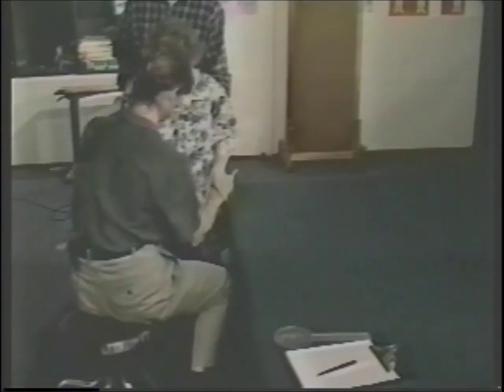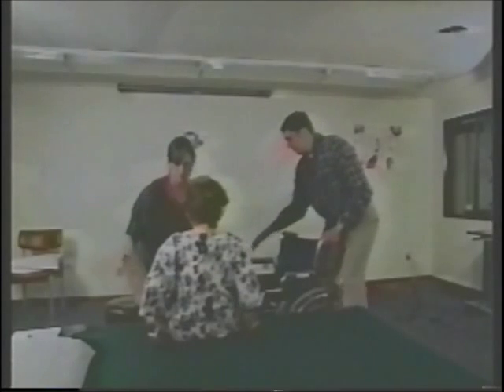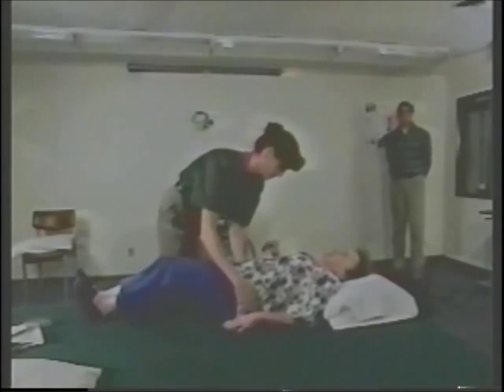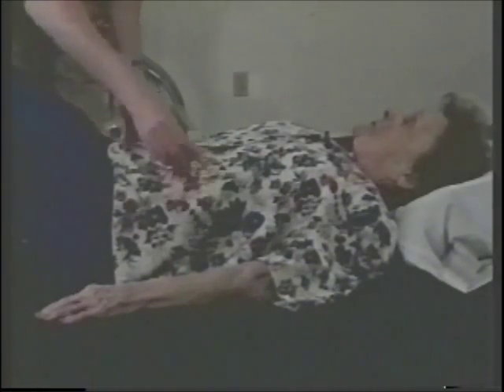Our final mat assessment will be with Lise. I'm going to have you lay down and put your head on this pillow. The first thing I'm going to observe while you're laying here is your trunk, to see if you have a nice straight trunk — it looks really good. The next thing I want to do is look for any fixed contractures in your back or neck area, so let's pull this out and let your head down.